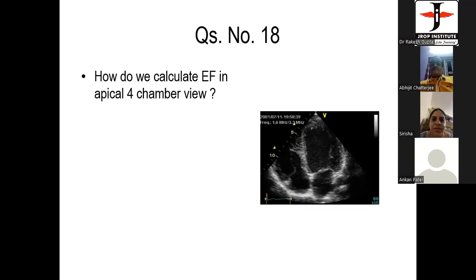We will start tracing from the septum downwards and till the mitral valve we will trace, sir. And we'll see that the Purkinje fibers are also included in the cavity itself. No. Sorry. See, there's a small technical mistake. You don't see the Purkinje fibers here. You mean to say that you will include the trabeculations on the side of the cavity. Yes, sir. Trabeculation. And what else, doctor, other than trabeculation? The papillary muscle. That should also be towards the cavity, right? Oh, sorry. Yes, sir. Papillary muscles.